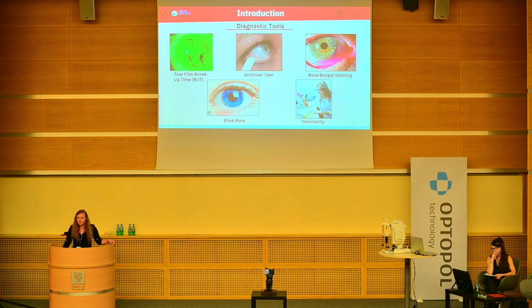Nowadays, the non-invasive breakup time, also called NIBUT, is the gold standard for minimizing the contact with the ocular surface. Therefore, we would also like to introduce a non-invasive breakup time test by introducing a dual visible and thermal imaging instrument that aims to address these challenges.